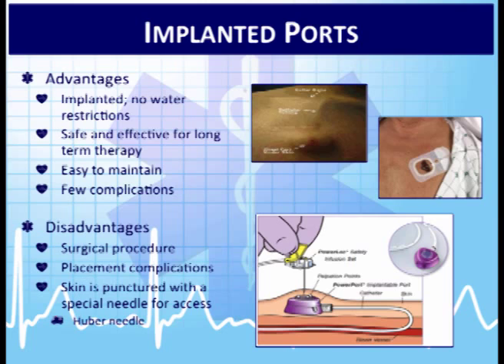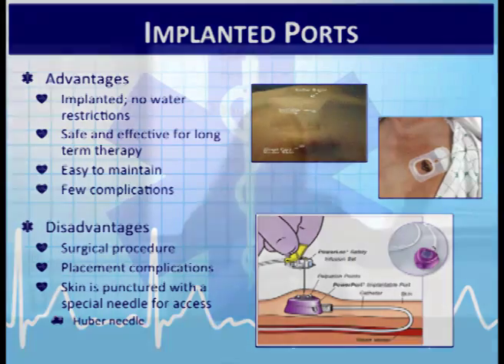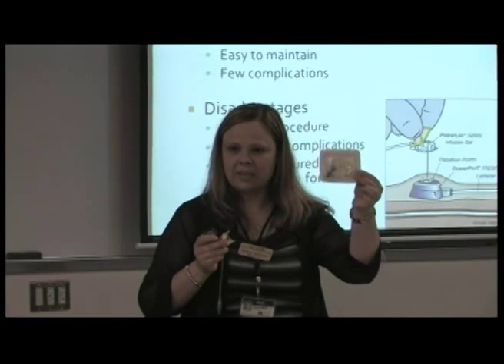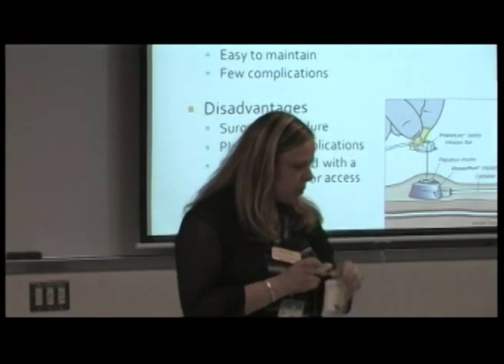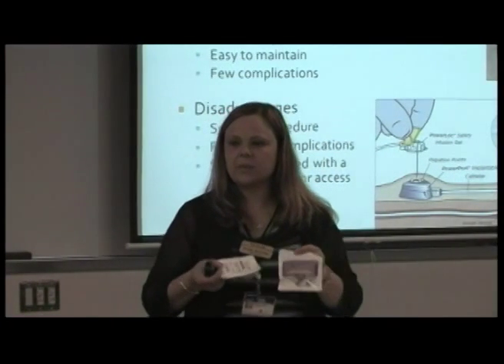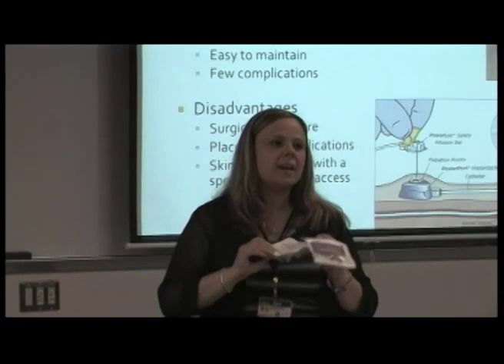Placement complications is for all of ours. Skin punctured with a special needle. It's called a Huber needle. So on the ambulance, we have to have this needle or the PowerPort needle to access these devices.